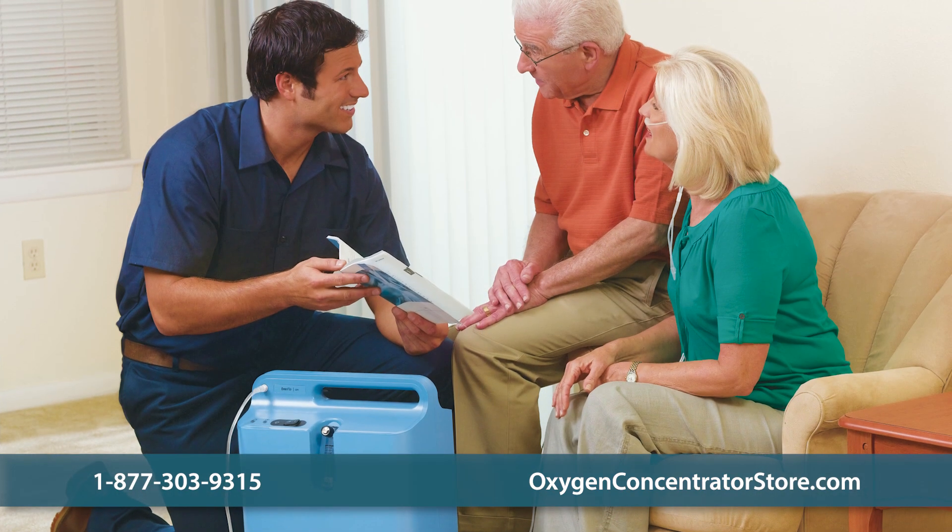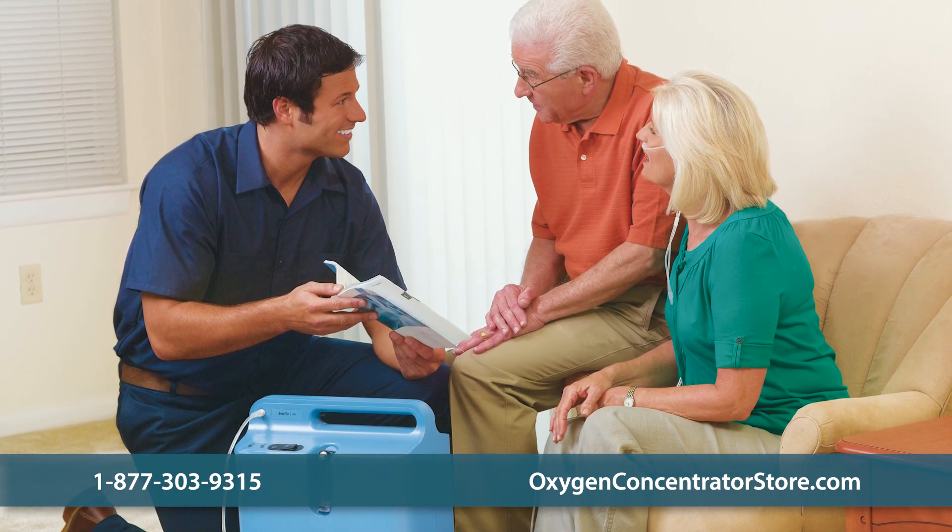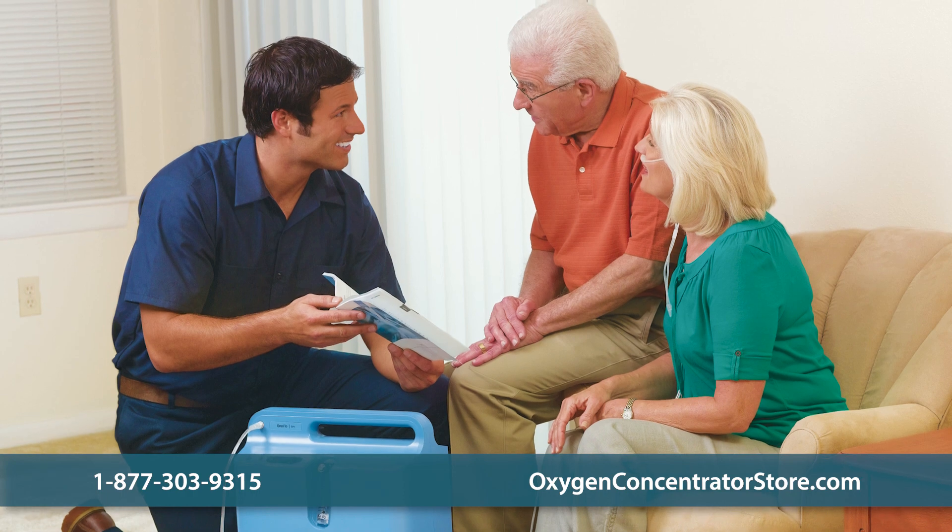With only two highly efficient filters and a lower energy cost than other home concentrators, the unit is easy to maintain and cost effective.